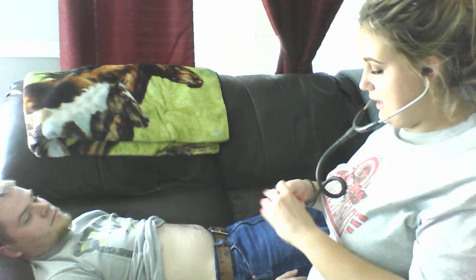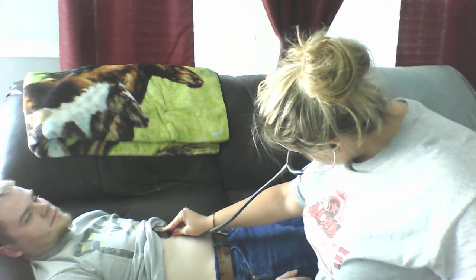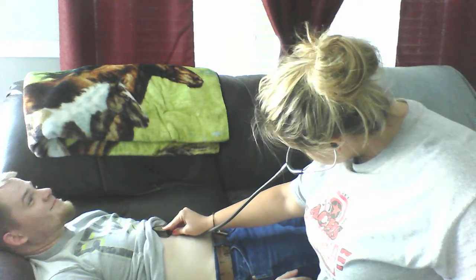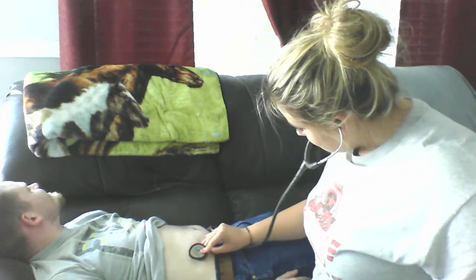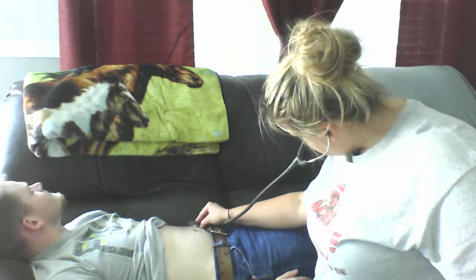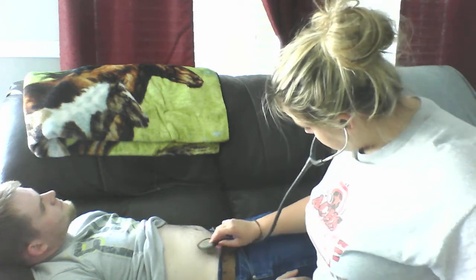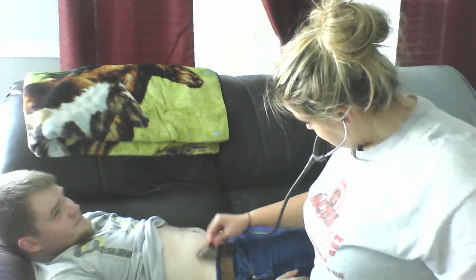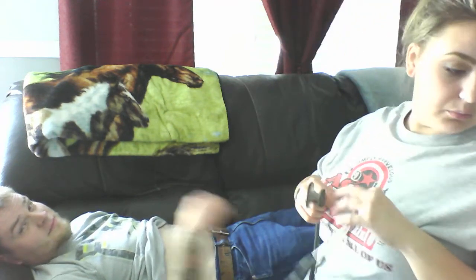We'll listen over the aorta. The inguinal. And femoral. And I don't hear any abnormalities there, so no bruits.